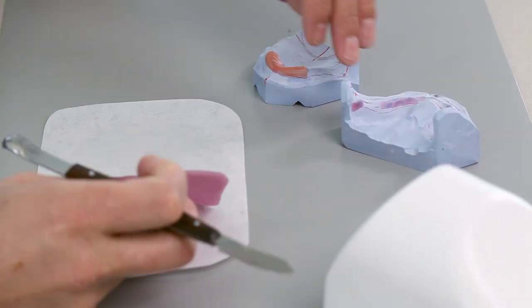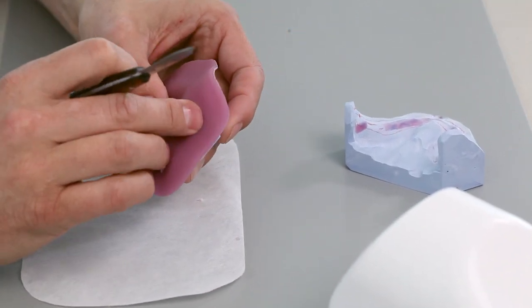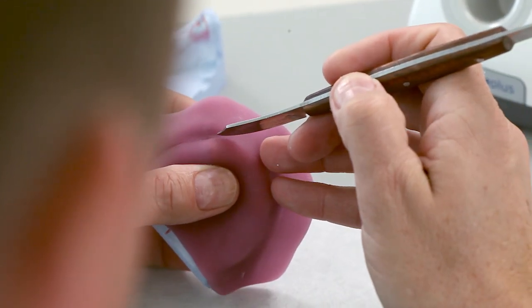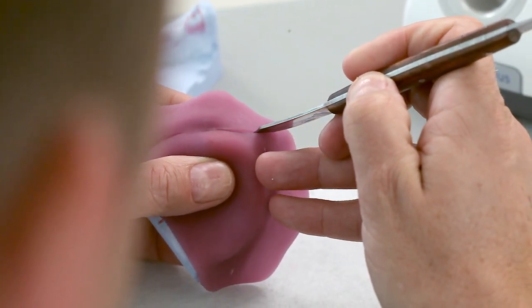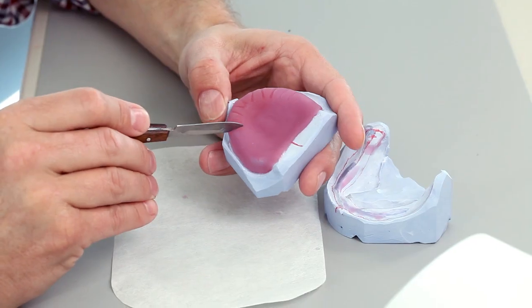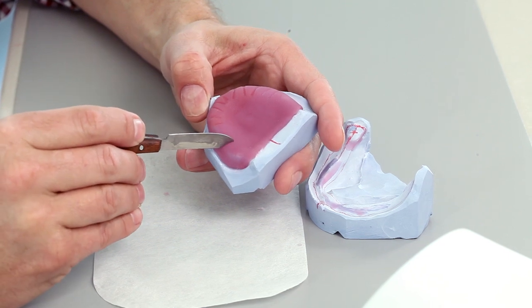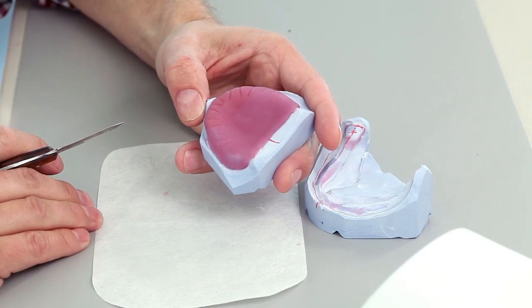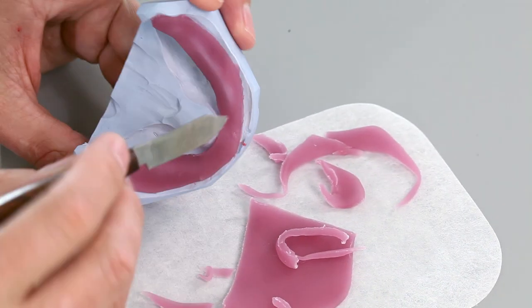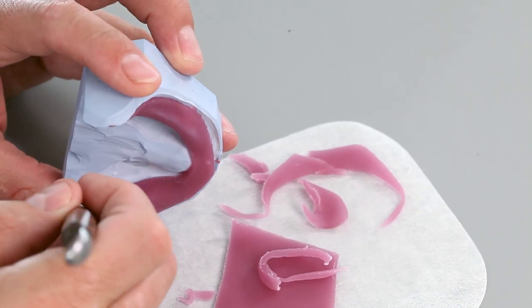For the custom tray, create an acrylic base within the maximum tray extension line. It is important to keep the movable mucous membrane unobstructed for the myodynamic expansion. To ensure the retention of the bite rim, create a retentive pattern into the uncured acrylic on the occlusal surface of the upper base. In the lower jaw, add a retentive railing to the base as space is limited.